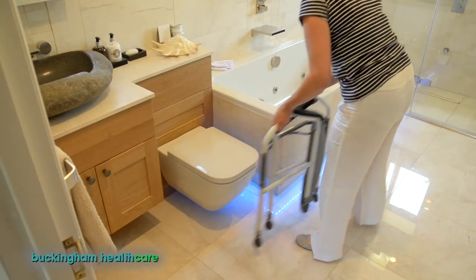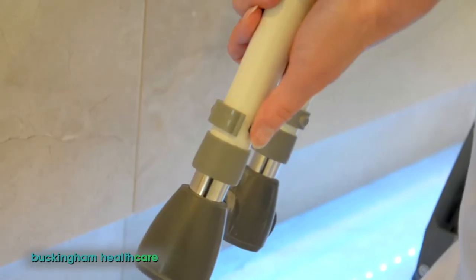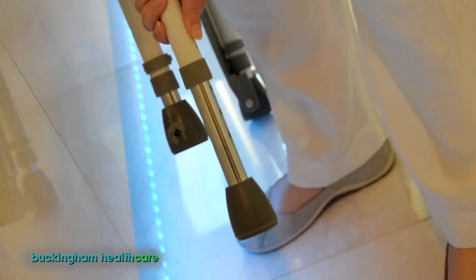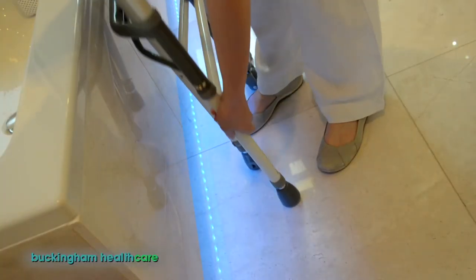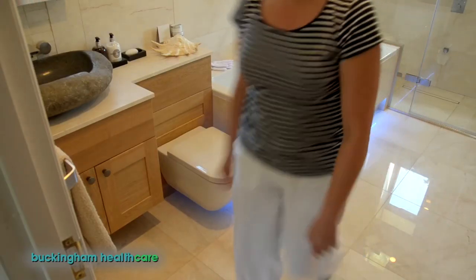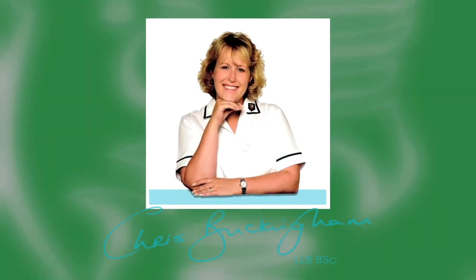The award-winning FoldEasy is the only fully height-adjustable and portable toilet frame, meaning anyone can use it, confidently, anywhere. The FoldEasy toilet frame — one of a range of products designed in the UK by Chris at Buckingham Healthcare, the company helping people to help themselves.